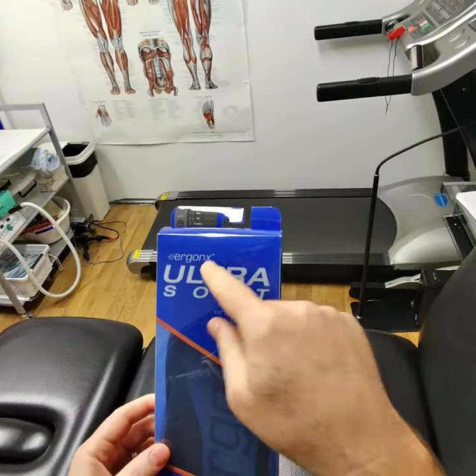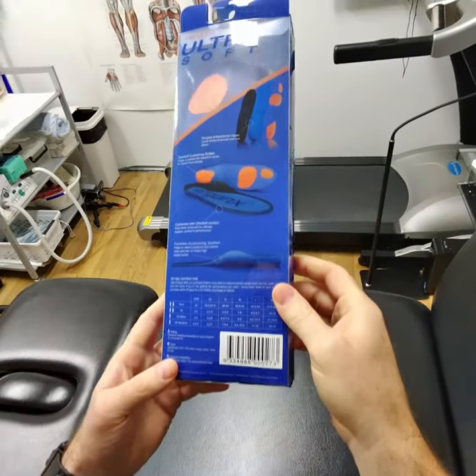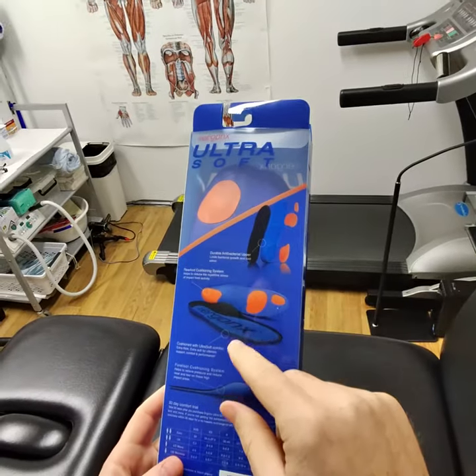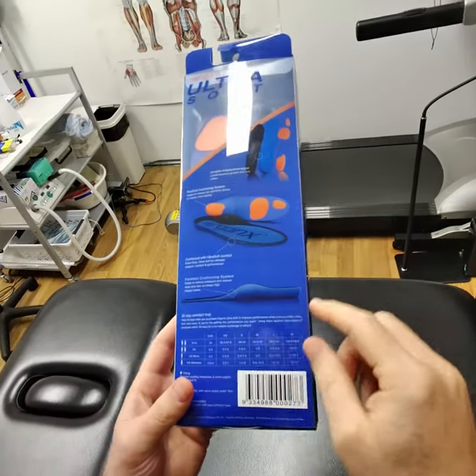Looking at the Ergonix Ultra Soft Orthotic Insole, it's a premium support orthotic insole by Ergonix and it's got a ton of features here on the back. It's antimicrobial, antibacterial, with cushioning positions in the forefoot and heel, and it's made from polyurethane foam.